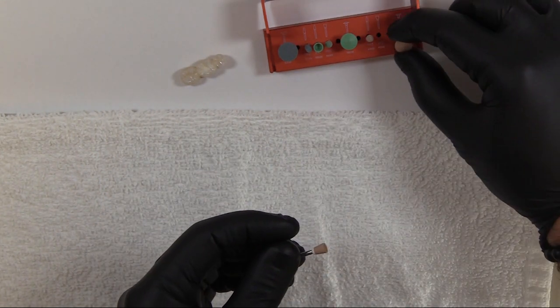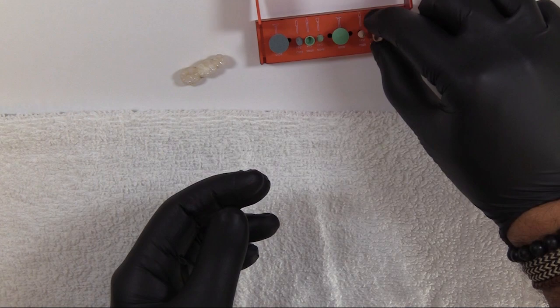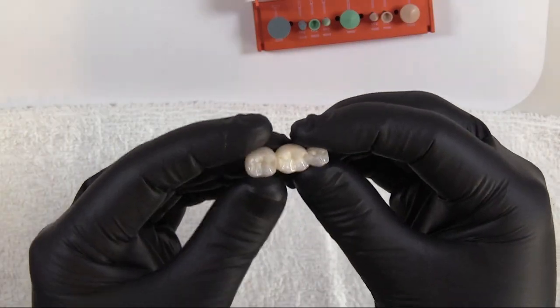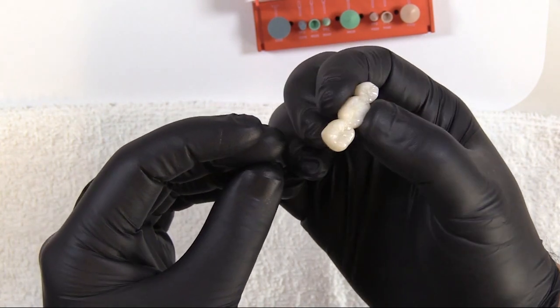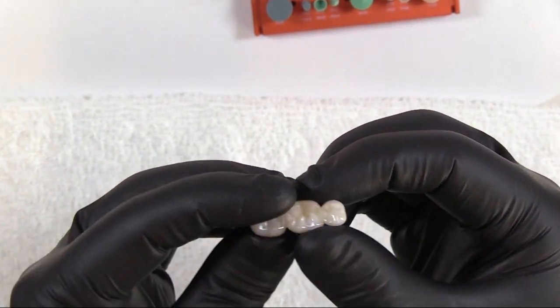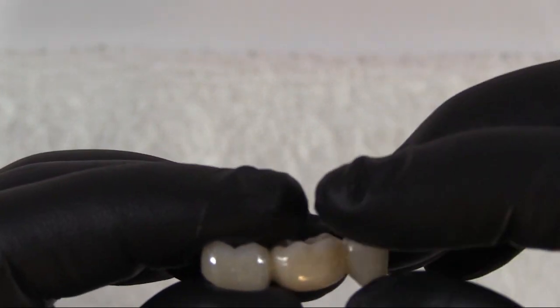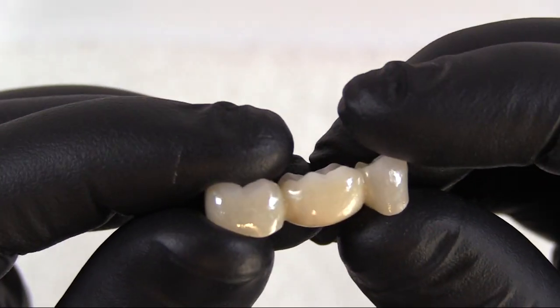We're going to go through a step-by-step process of how we like to adjust and polish zirconia. This is a three-unit zirconia bridge. I'd like to have a checklist as far as how to assure we have complete seat of the restoration.